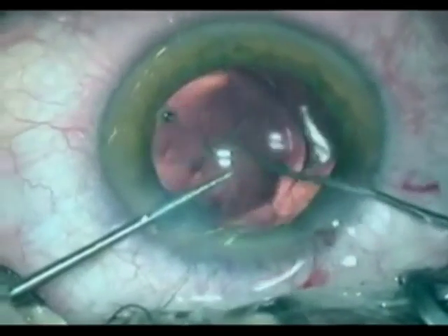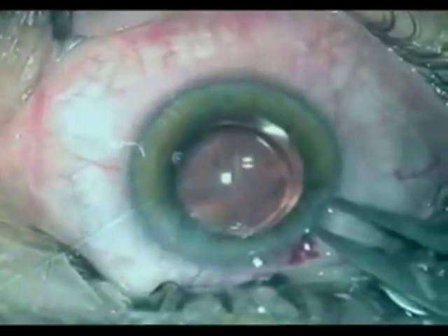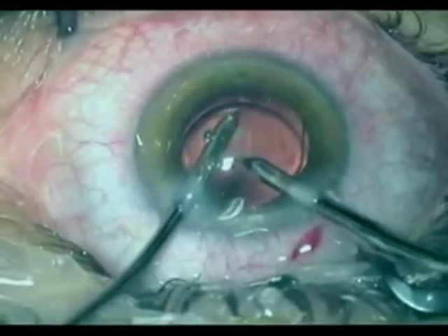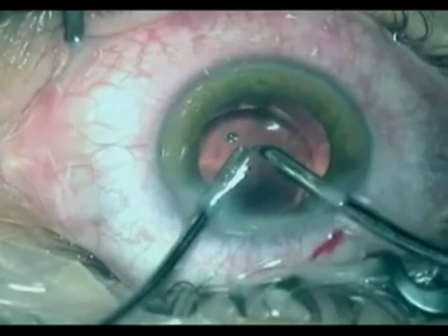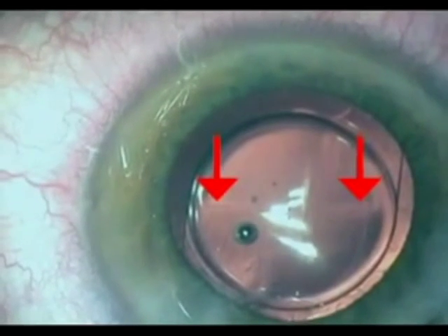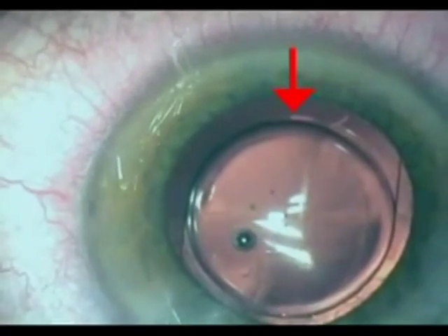The lens has to be rotated and placed with a notch inferiorly located, and two lines defining the sector placed horizontally. The total surgery is performed through incisions of 2 mm, then the viscoelastic is removed, and the surgery is finished. This is how the lens looks at the end of the surgery, with the sectors indicated with the lines and the notch, which means that the lens is correctly placed inside the capsular bag.